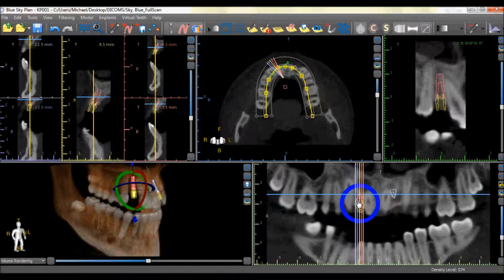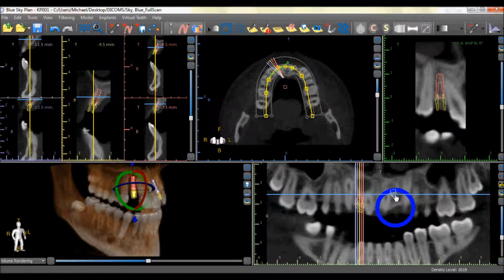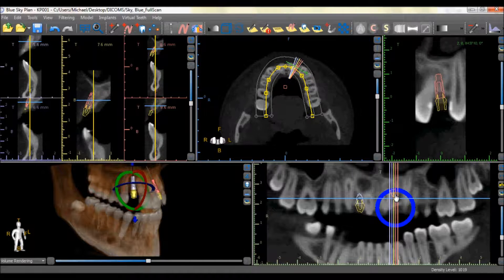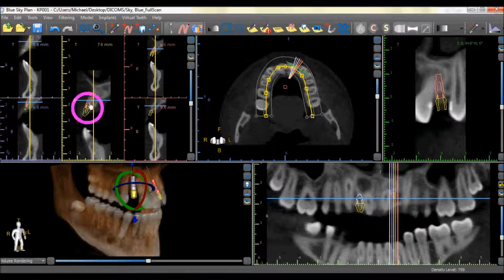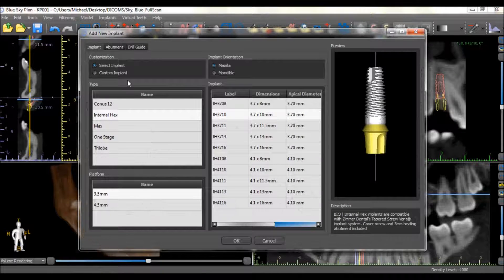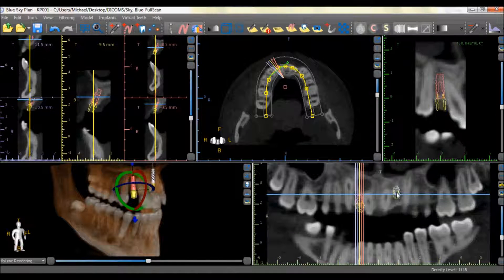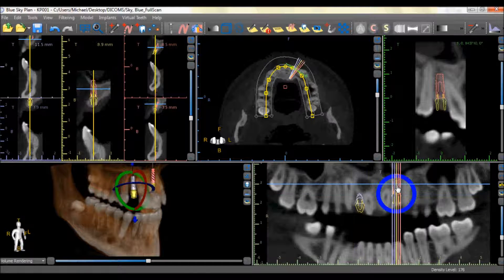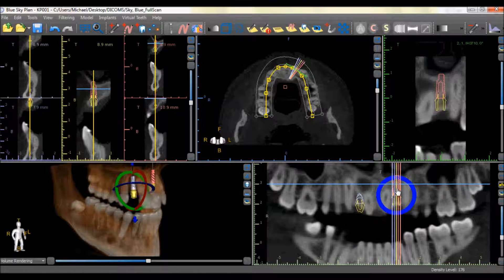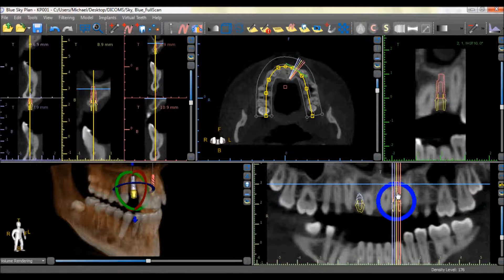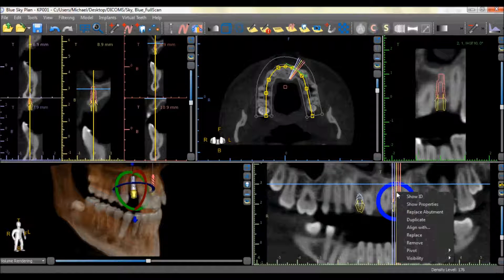Left-clicking on an implant makes the implant active and the implant appears in all the relevant views. We can also align a new implant to the angle of an existing implant by clicking on the implant.